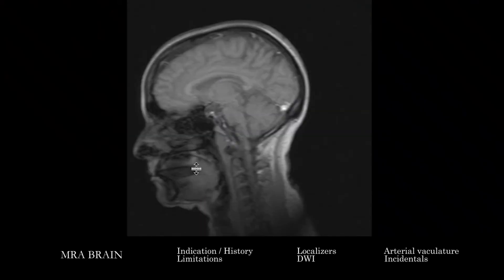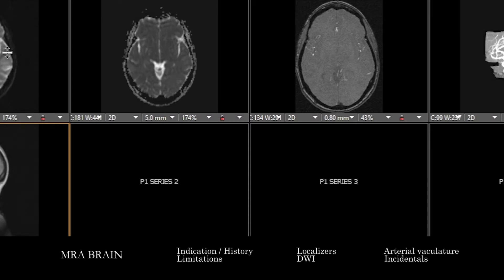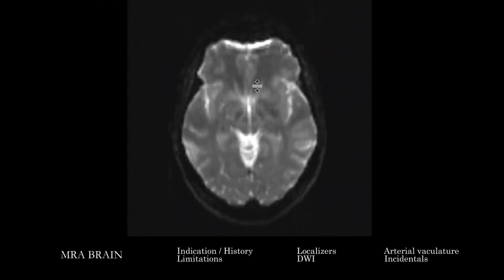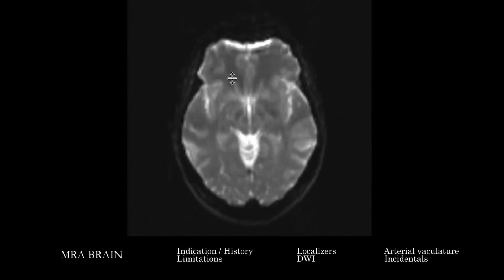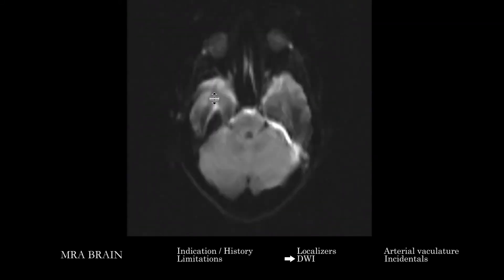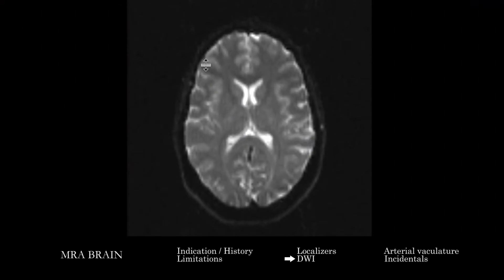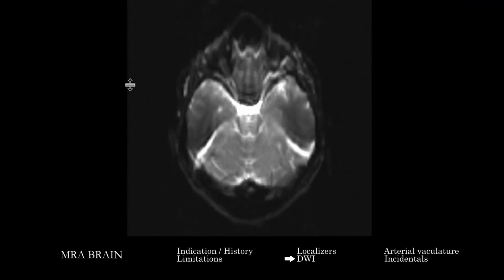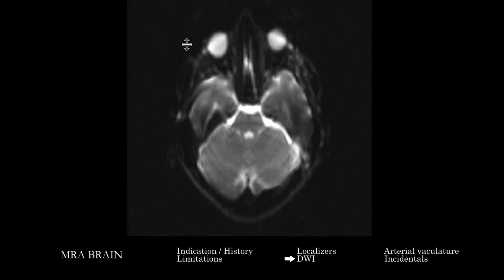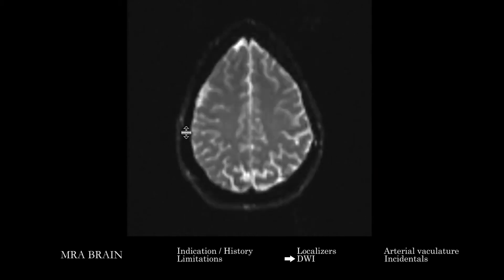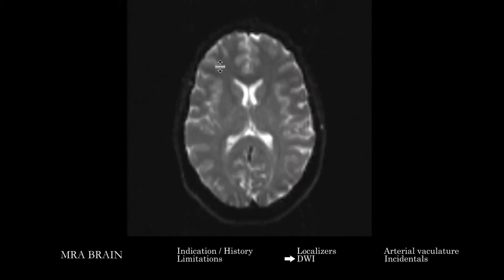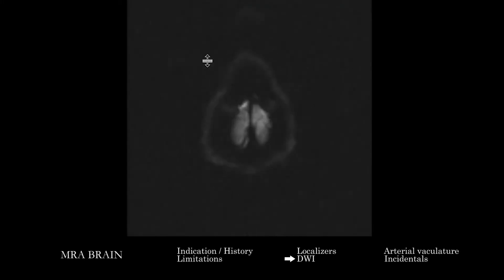Once you've looked at the localizers, before moving to the angiographic vascular-focused images, go through the DWI images provided. Here's the B0. Remember that the B0 — if we don't have SWI images and the MRA brain is the only thing being done — can be used as a kind of 'poor man's susceptibility image,' a suboptimal susceptibility-weighted surrogate if you need to assess any susceptibility or blood product.